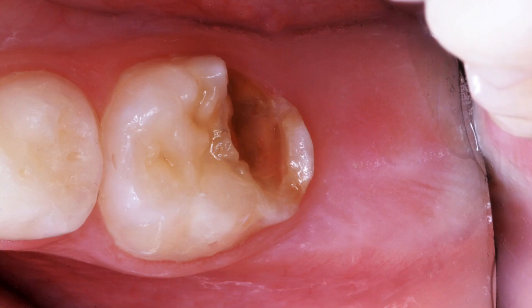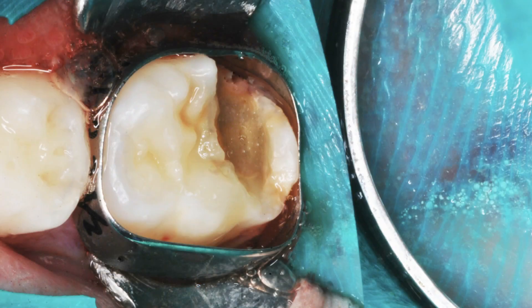You were nice enough to share a case with us where you used Theracal PT. Why don't you go ahead and walk us through this? Here's a five-year-old — I believe the lesion probably started out as a hypomineralization, but it became carious, and the caries infected the tooth really to the pulp chamber. We could see that radiographically. Here we've isolated the tooth with infiltration anesthesia, put the rubber dam on, and in this case I put an orthodontic band over the tooth to stabilize the clamp because the crown wasn't very tall. The orthodontic band stabilizes so we have a beautiful working field to control the moisture and the cheeks. I've never seen that before — I recognize it as an orthodontic band because it's got numbers on the side. The orthodontic band is pushed into place with a serrated amalgam condenser.